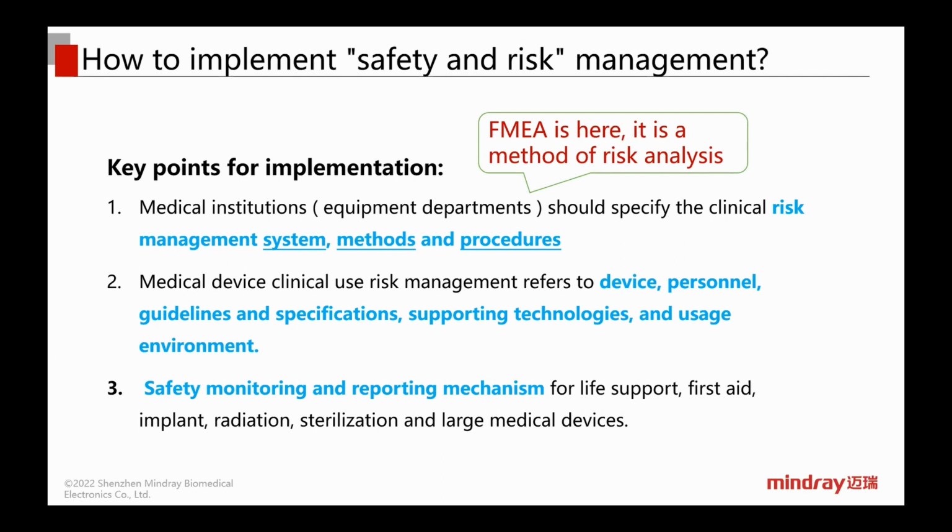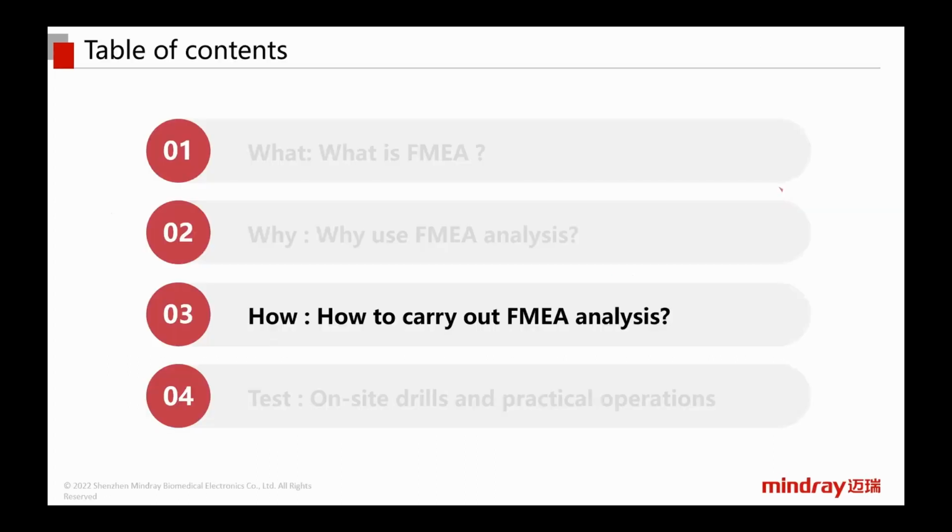Also, we can consider the operators of this device and the technical systems of it, and even the working environment of this device. Lastly, from the most direct point of analyzing, how to monitor the safety of device operation on patients and how we can record and report in case of emergency. This is something we'll discuss shortly in the next section of how to carry out this analysis step by step.